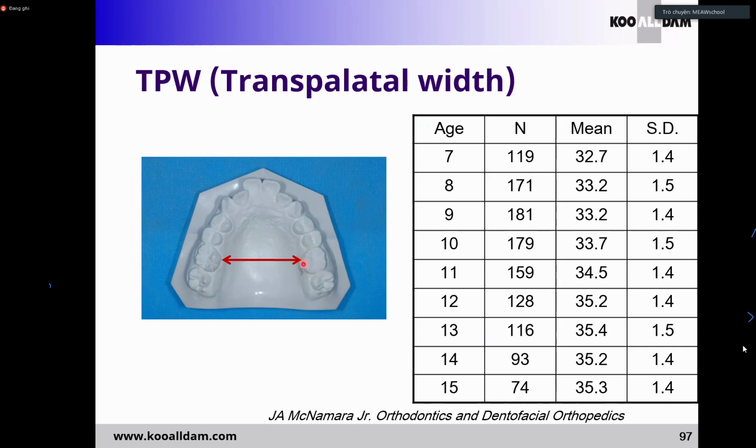After eruption of the upper first molar, the distance will grow and increase like this into 35 millimeters. So after inserting TPA, we should allow upper first molar expanding.